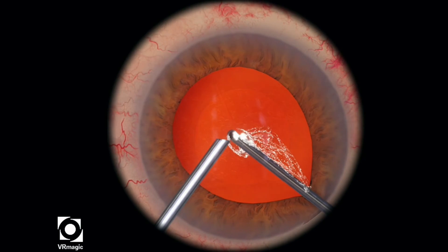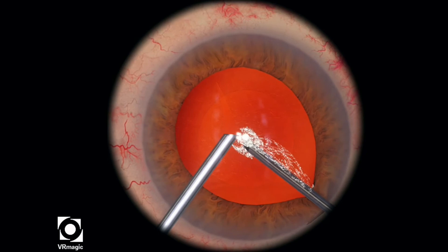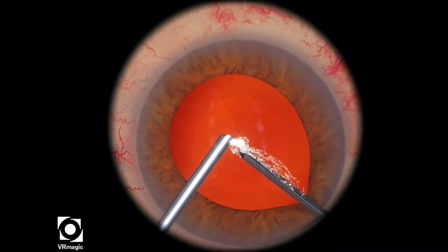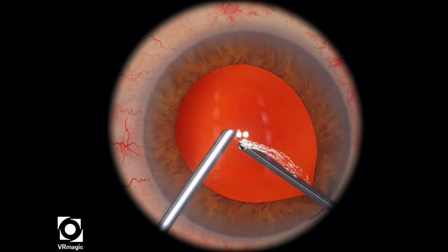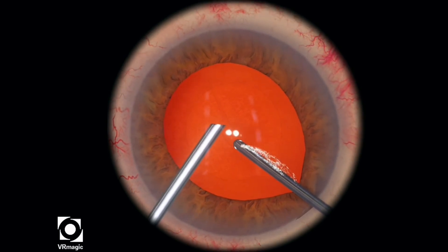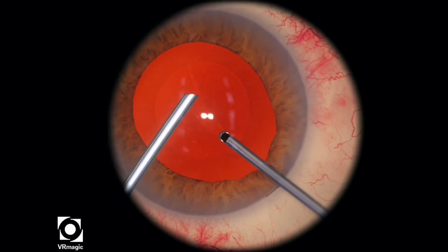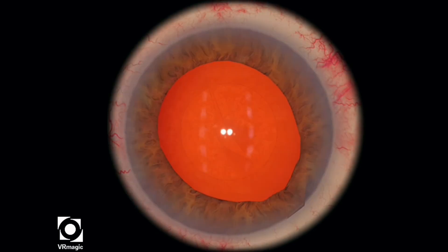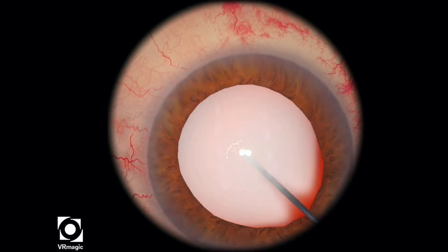Some of the vitreous is going to kind of go around your cutter. You sometimes want to use an up-and-down motion in order to get a bit of the vitreous and engage it properly into the mouth of the cutter. Stay there, don't worry about the stuff that's leaking towards your port, and then start to cut a little bit more. That looks pretty good, but there's probably some left, and the machine really wants you to go after all of the vitreous.